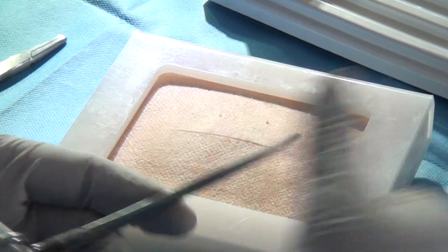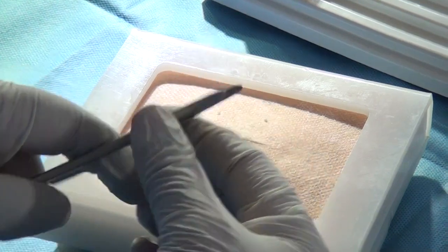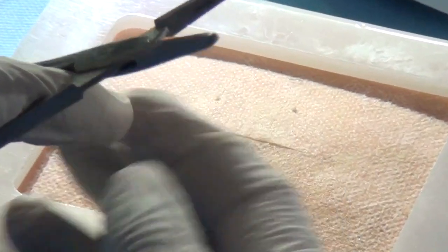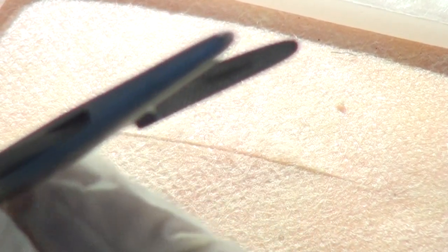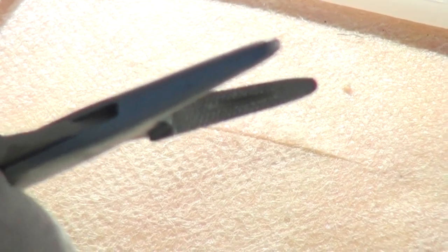And in addition to that, I would have a little slit here. This is where the needle should sit. Can you zoom here please? I'll show you how to get a suture out of the wrapper and then we'll get on with it. Pay attention to every step. Each mistake would be noticed by people who are marking you when you're doing it. So that slit is where the needle should be.